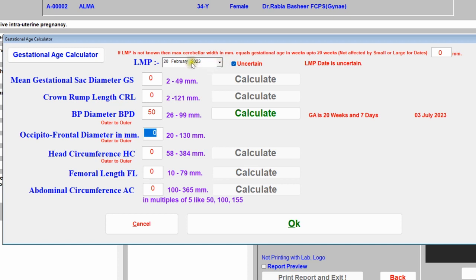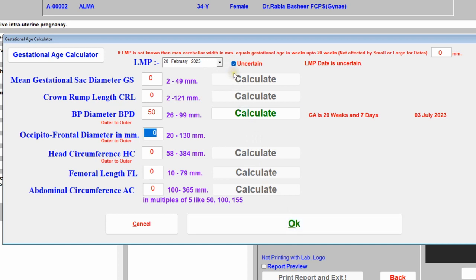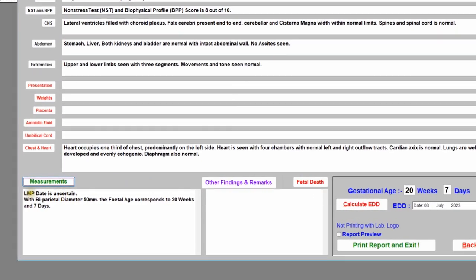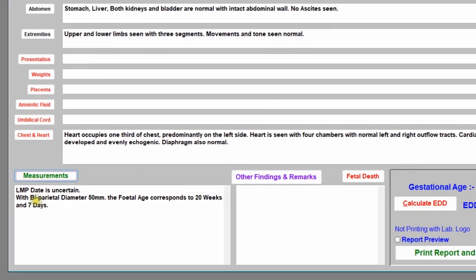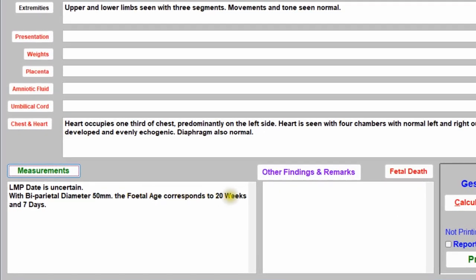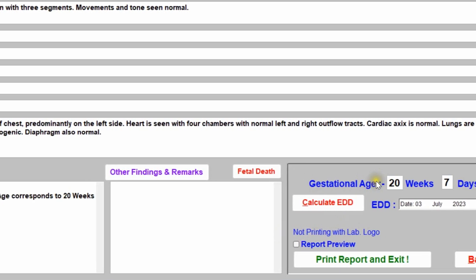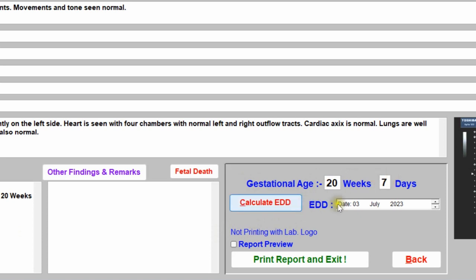If you don't enter the LMP date — either by selecting an exact date or by clicking 'Uncertain' — the OK button will never be available. You must at least provide the LMP date or click 'Uncertain', then enter any biometry and click OK. The measurement summary shows: LMP date uncertain, BPD 50 mm, fetal age 20 weeks 7 days, EDD 3rd July 2023.